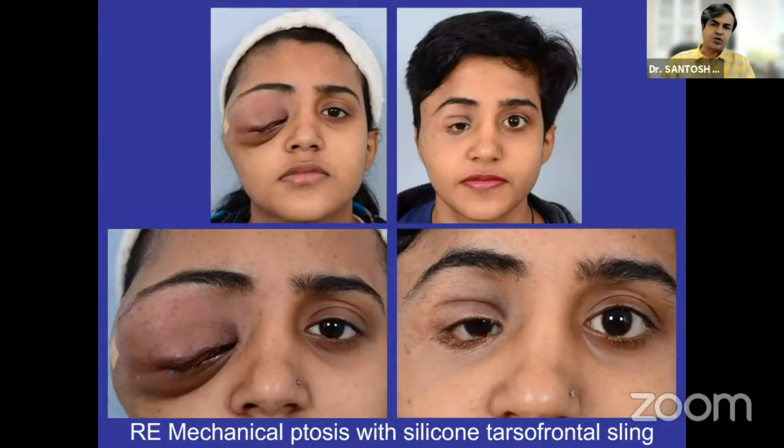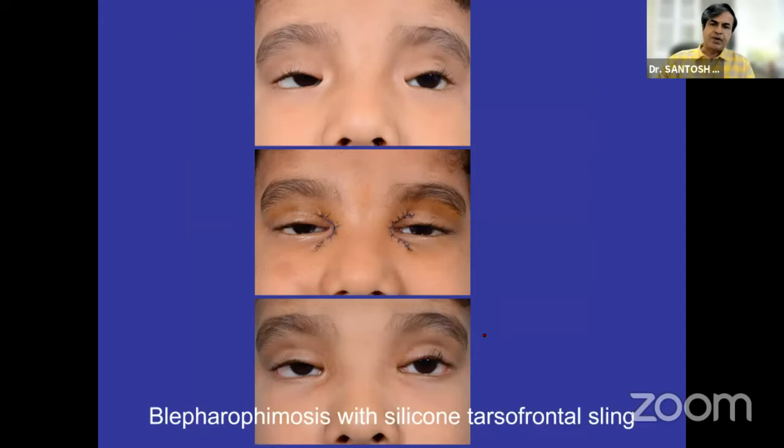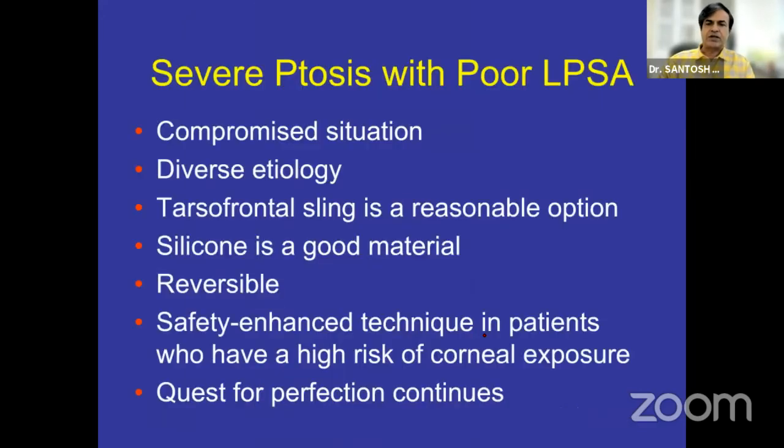In patients with neurofibromatosis, you can debulk and then do a sling. Silicon sling can take the weight of the bulky eyelid despite having residual neurofibromatosis. In traumatic ptosis where levator action is poor, you can again do a sling — and again to show that lagophthalmos is not so severe. Patients with blepharophimosis can also be treated with bilateral silicon tarsofrontal sling.